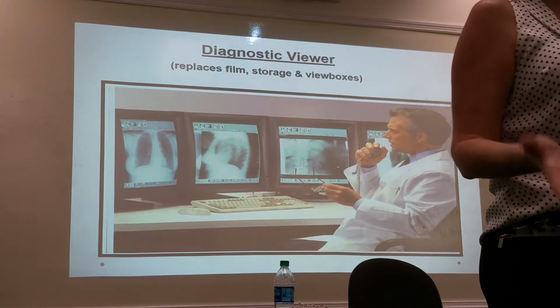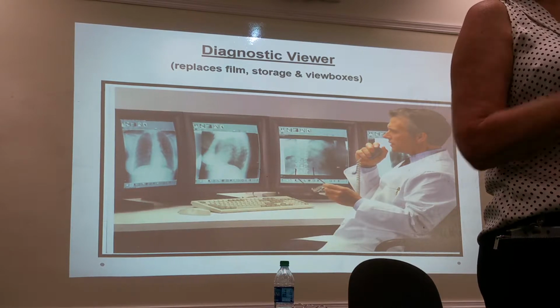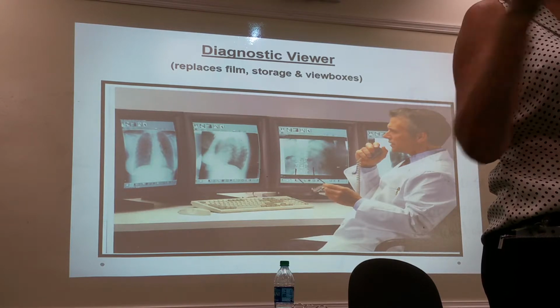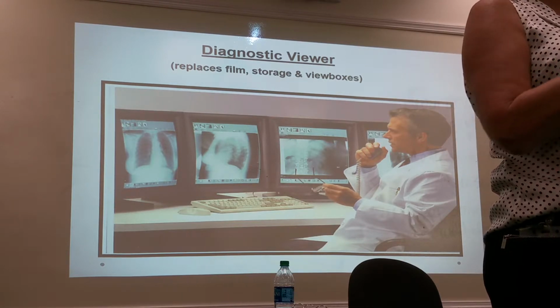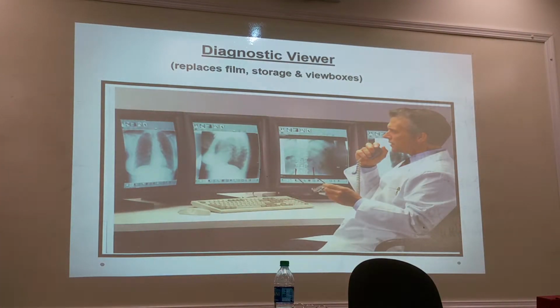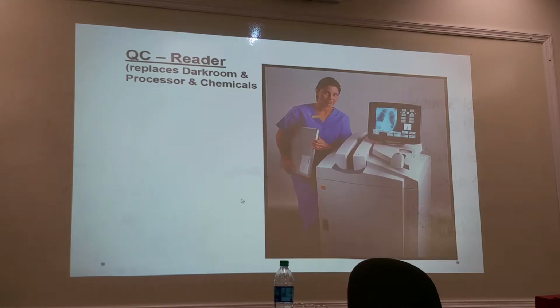Well, it was the same way with X-ray. Too much information, we didn't have enough storage drive to hold it all. And so it took finally to where we can now store large files on our computer disks. So that was the holdup. And so now we're able to replace our film, replace our view boxes and our processors. And this is what the radiologists are doing now. They've got these big, fabulous monitors that they look at the images and dictate now. So this is gone, bye-bye. Never thought I'd see that day.